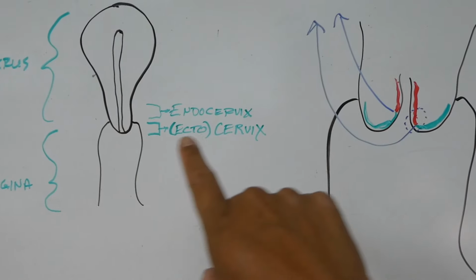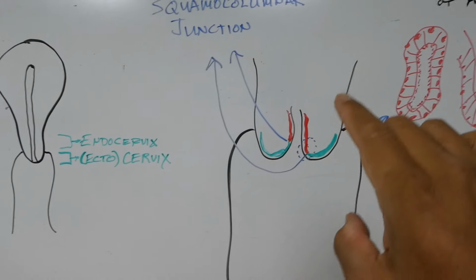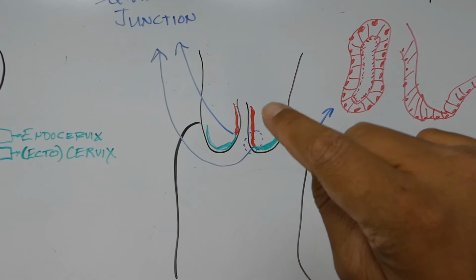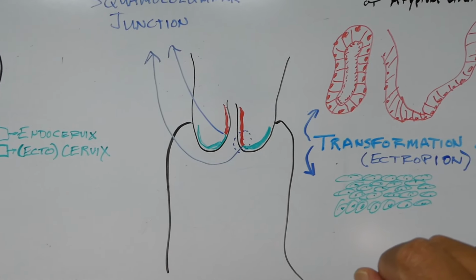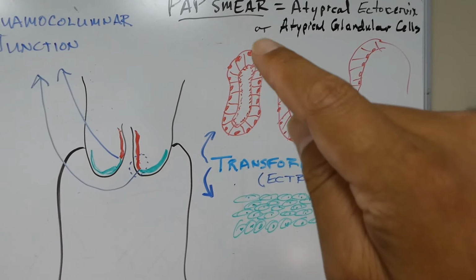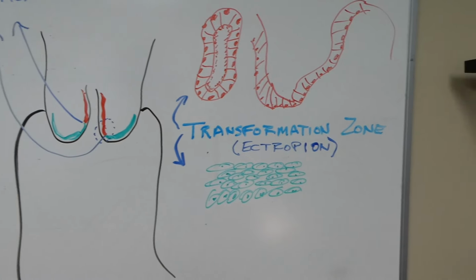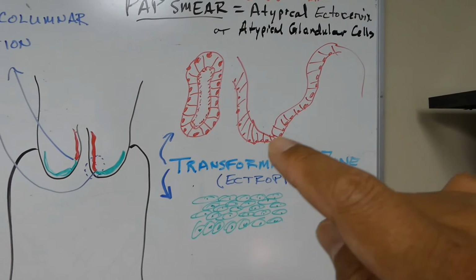So, just a magnification here of the cervix and the vaginal canal. So this red portion signifies the endocervix. What the endocervix appears like is these columnar cells, either in a cross-section gland formation, or it can be more of a cleft, depending on the section under the microscope.